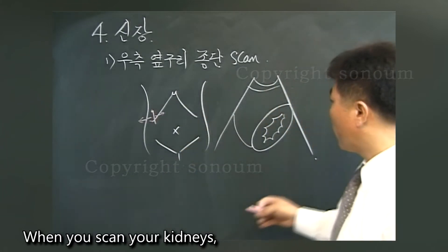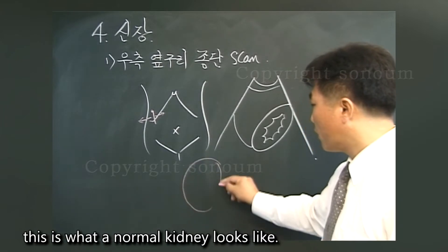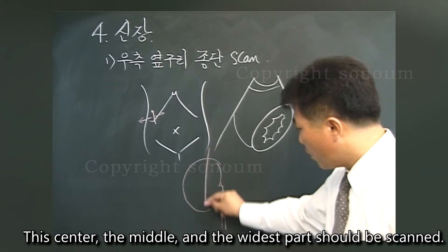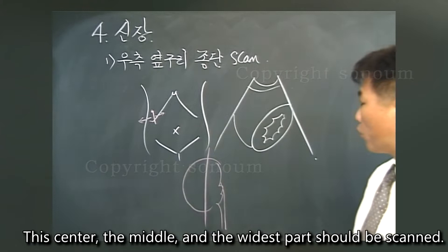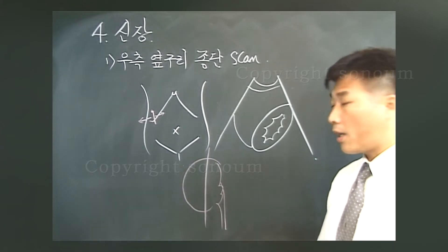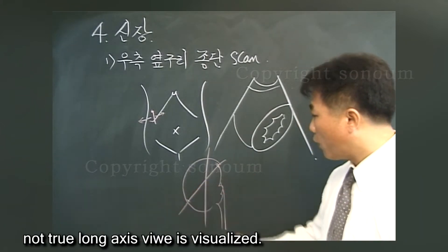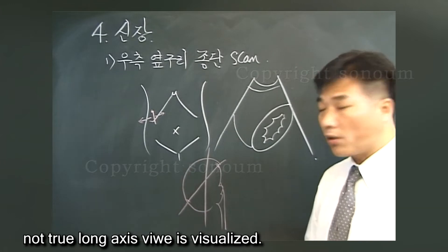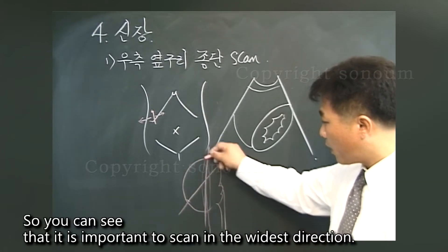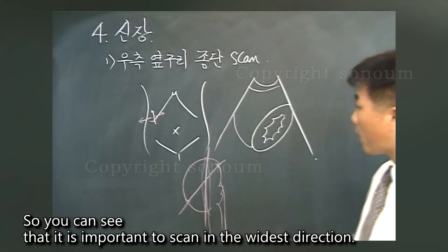When you scan the kidneys, this is what a normal kidney looks like. The center, the middle, and the widest part should be scanned. If the kidney is obliquely sectioned, a true long axis view is not visualized. So you can see that it is important to scan in the widest direction.